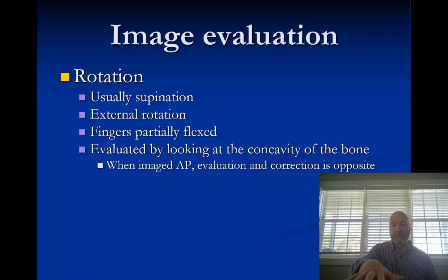So you position your patient perfectly and you put the hand down, and the longer you have your patients in position, the more likely they are to move. And it's subtle sometimes. So what happens in a lot of cases is that the patient has their hand flat, you go around, and then you start setting your technique. And the longer you're behind the control panel, the more the patient feels like they've been abandoned. And what happens is they start relaxing their hand. And if you saw it, what happened is I relaxed my hand as my thumb came down. And what that's going to do is push your hand into an external rotation oblique.